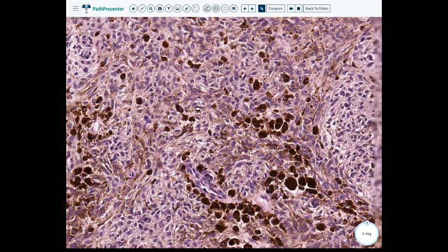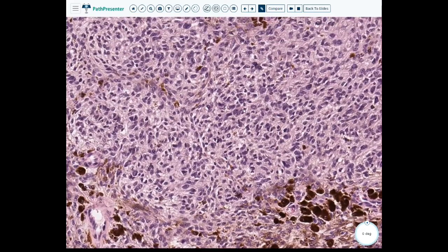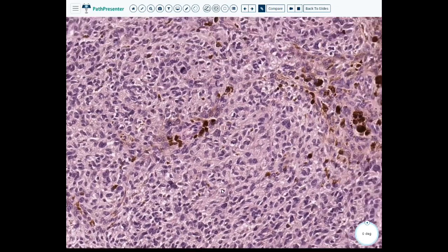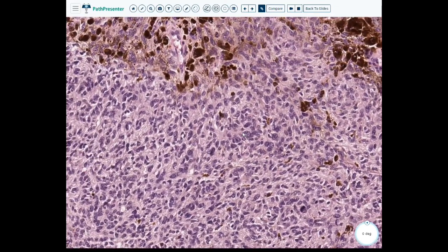You have vascular spaces. So what this is, this is a blue nevus, but there's so many cells going on here. So this is actually a cellular variant of the blue nevus, which is not one that I believe I listed within your variants in the lecture.